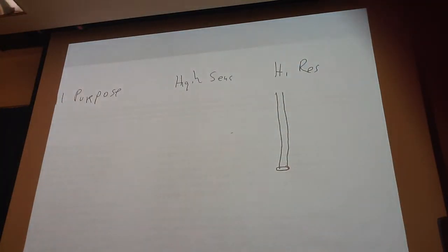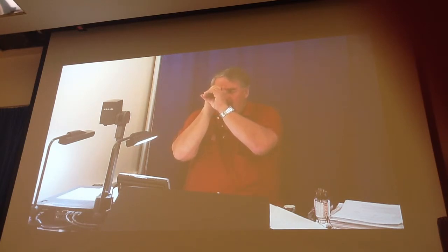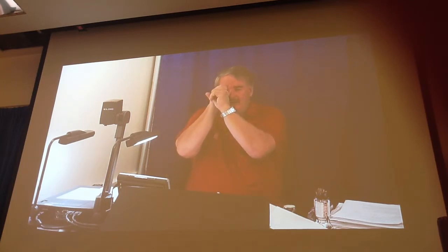If you want to see what it's like at home to do this, a long tube with a narrow opening, yeah, if you kind of think of looking around the room right now, you're getting in basically all of the information from everywhere, right? Okay, if you put your hand up like this and close your eye, this is what the septa and the collimator do. And then if you put your other hand up there, you notice that it's only allowing a little bit of light coming in a certain direction to reach your eye. And then you can make that even smaller if you want and get more pinpoint. And that's basically all you're doing with these collimators.